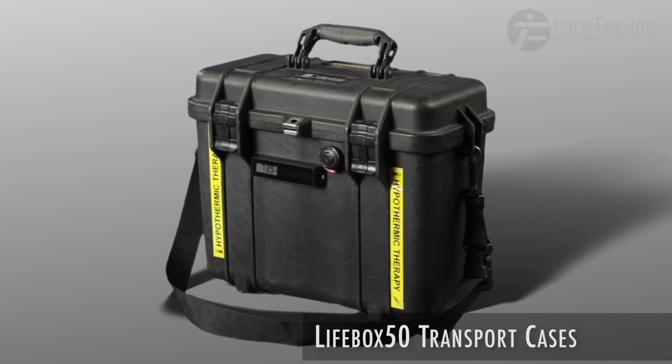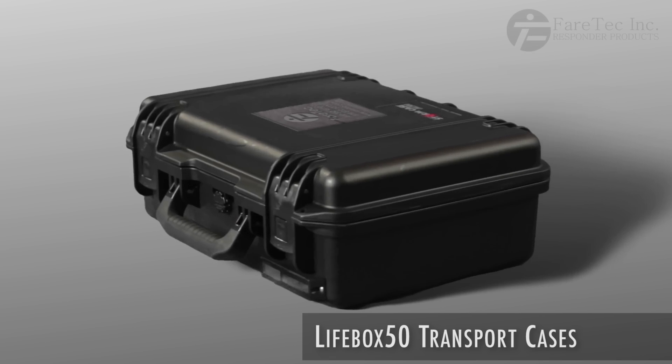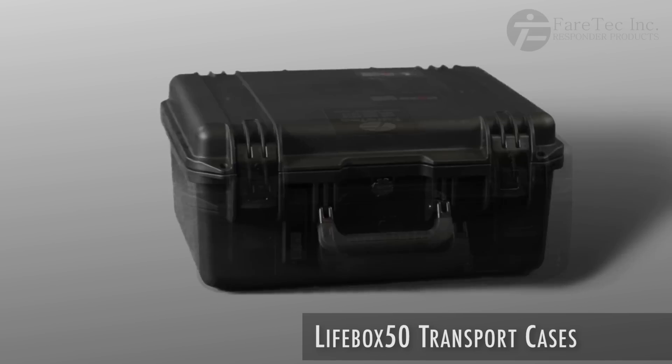Introducing the Lifebox 50 climate controlled container series. The Lifebox 50 has been designed to transport temperature sensitive supplies.